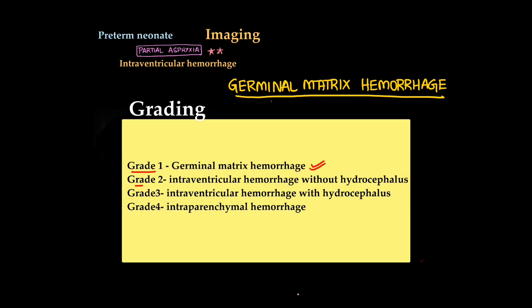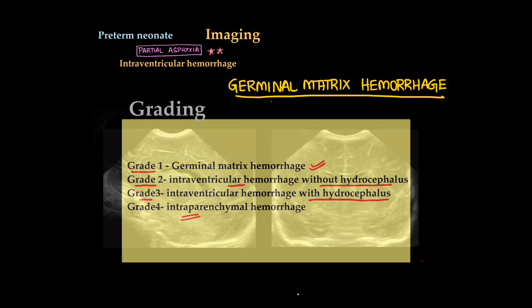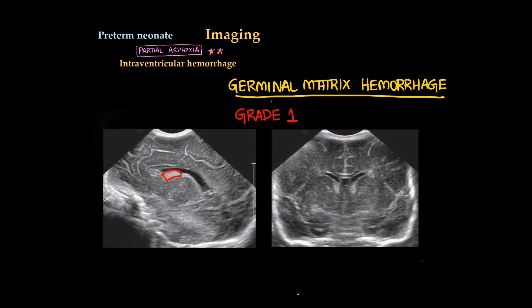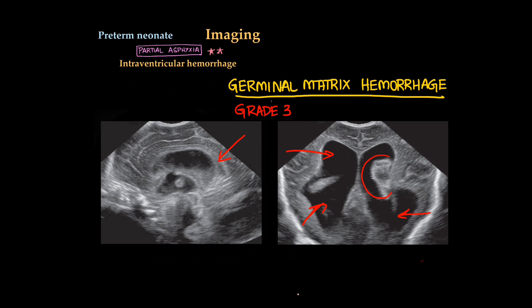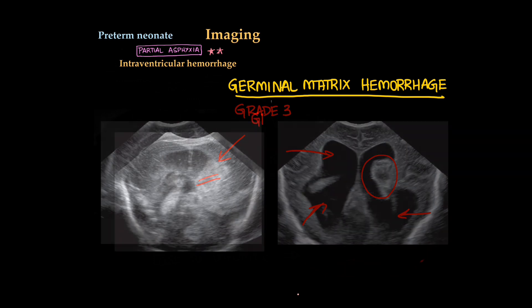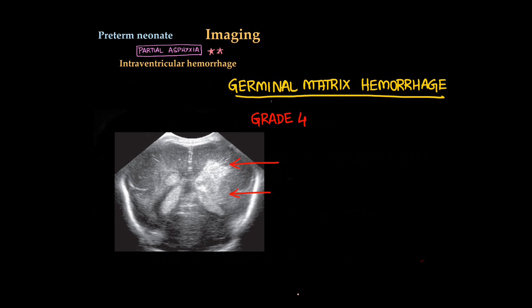Grading of intraventricular hemorrhage: Grade 1, only germinal matrix hemorrhage. Grade 2, intraventricular hemorrhage without hydrocephalus. Grade 3, with hydrocephalus. Grade 4, parenchymal extension of hemorrhage, intraparenchymal hemorrhage is also present. We will see one by one with images. This is grade 1, sagittal and coronal sections. Here you can see hemorrhage only in the caudothalamic grooves, germinal matrix hemorrhage. Grade 2, intraventricular hemorrhage without hydrocephalus. Grade 3 shows hydrocephalus, blood clot can be seen, hemorrhage present. Grade 4, intraparenchymal hemorrhage.